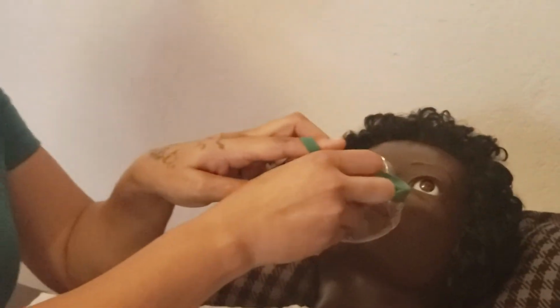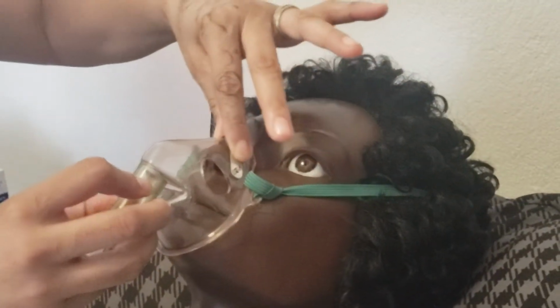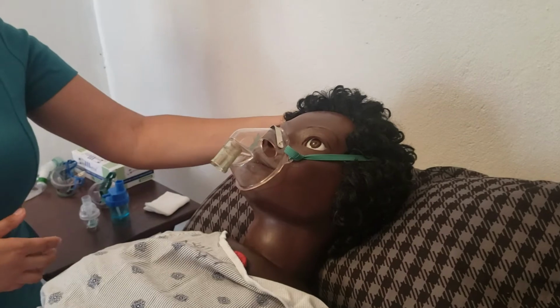This doll can use a small, so we will put the mask over the face and extend the straps over the head, adjusting the nose clip. Ensure that your patient is comfortable, and then they can remain with this breathing normally.